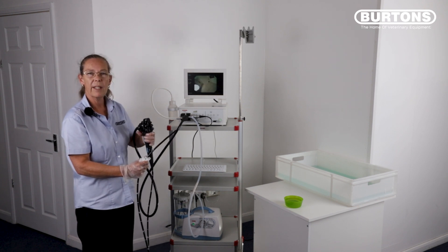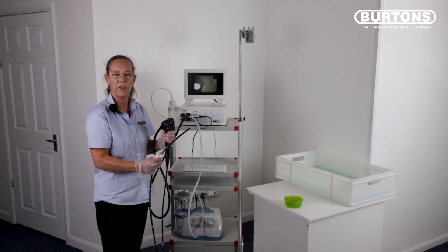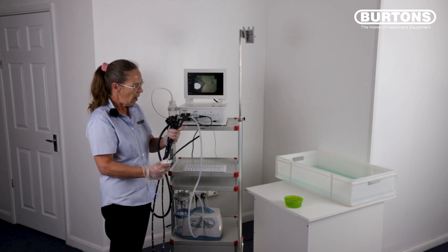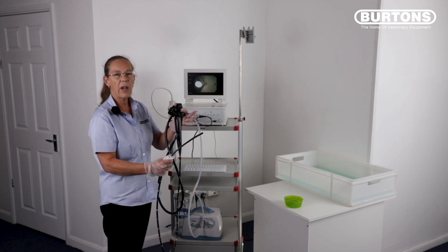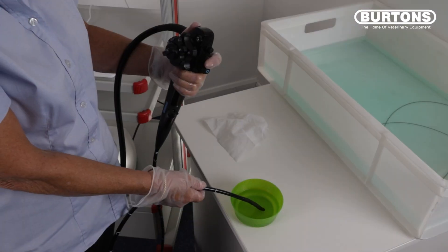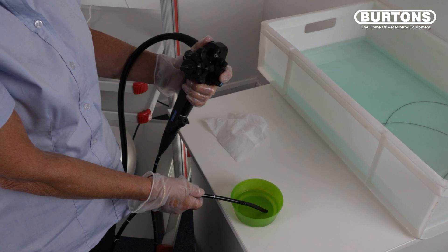With your suction unit and your pump still turned on, and as long as you're confident that you haven't caused any damage to the scope during the procedure, place the tip of the scope into some clean water and cover and press the red piston down and aspirate approximately 100 to 150 ml of clean water through the scope.